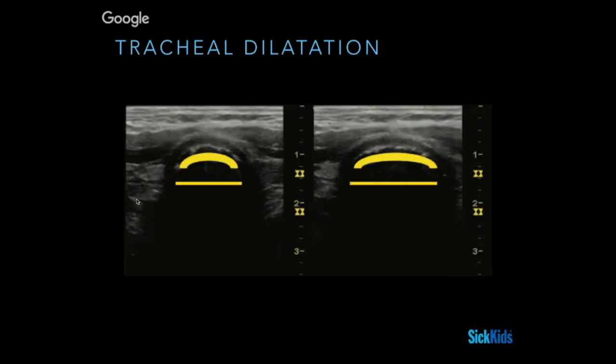Because if your cuff is inflating your trachea, let's say 2 or 3 centimeters below where you actually want your cuff to be, that can certainly be still right mainstem, but you might actually see this finding in the place of where you're looking for the ultrasound, right? So you put your ultrasound at thoracic inlet, and you will see some dilatation, but that actually might just correspond to some downstream expansion of the trachea. So people who've done this before, and more than I have certainly, would contend that this is not as good as the next thing we'll talk about, at least in kids.